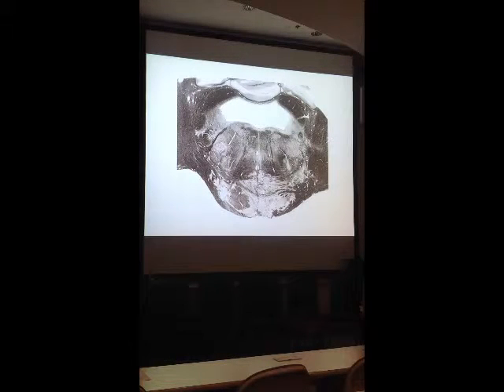Now, finally, with regard to this slide, perhaps the main reason that it's in this collection of slides I'm looking at is that this is the landmark section that shows two major cranial nerve nuclei, one here and one here. I think you remember that I've given you a name for this landmark, which neuroanatomists always know well. It's called the facial colliculus in the floor of the fourth ventricle.